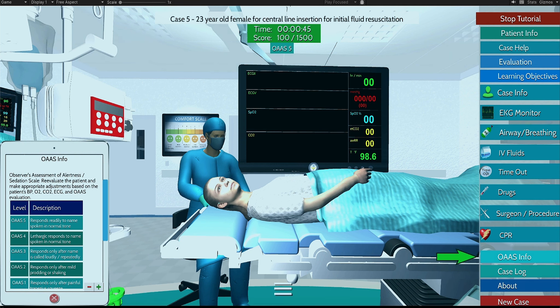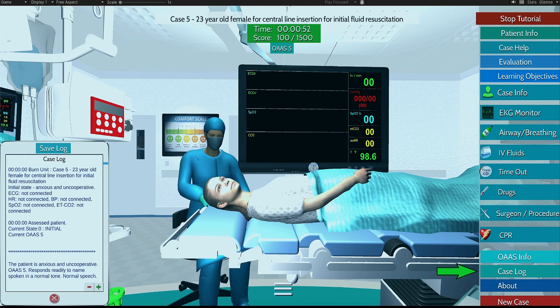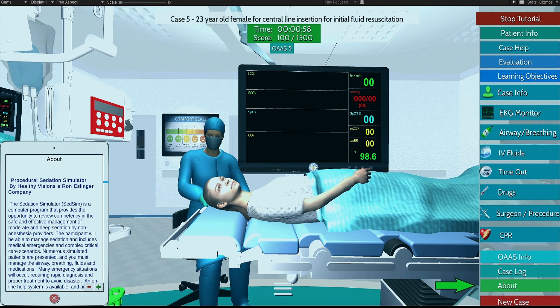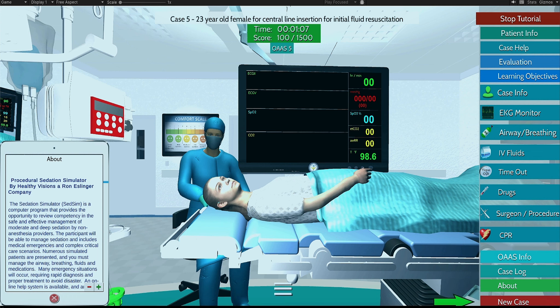This is OAAS evaluation info with descriptions for each OAAS level. This is where you can save a copy of your case log once your case is complete. Learn about this sedation competency simulation. This is where you can select a new case at any time — current case progress will be restarted.